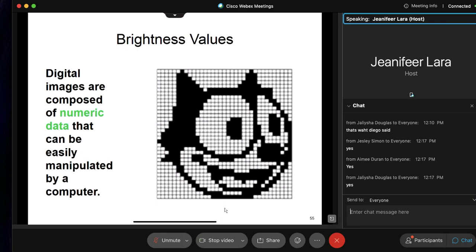Now, this image tells us a lot. We could go back and count all of these pixels, and it'll tell us what size matrix it is, because matrix will come like filament sizes, large and small. Large and small, or medium, is just going to be depending on how many rows and pixels there are. But let's take a look at the brightness levels.